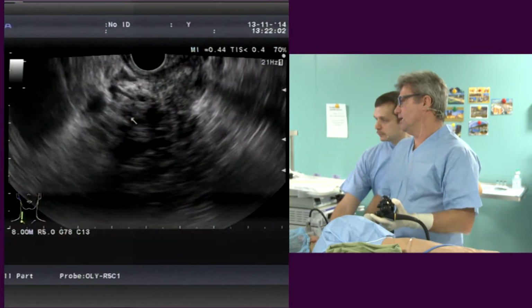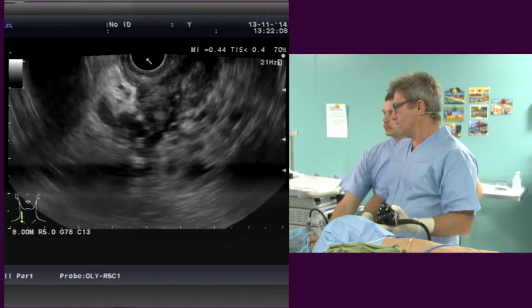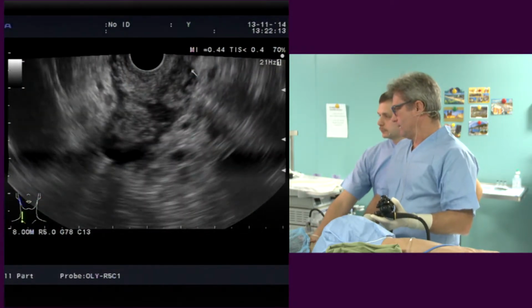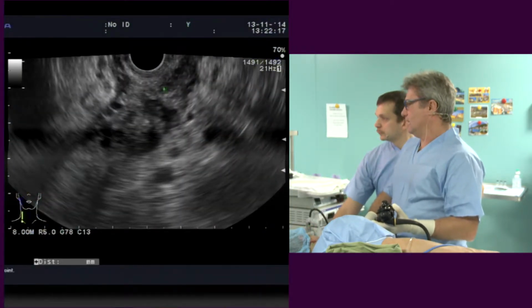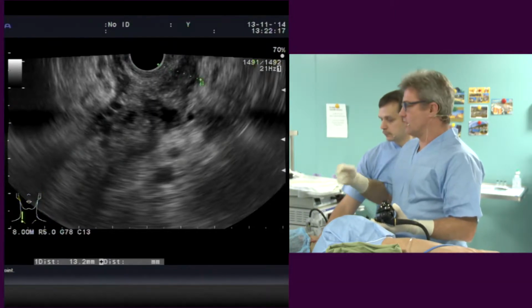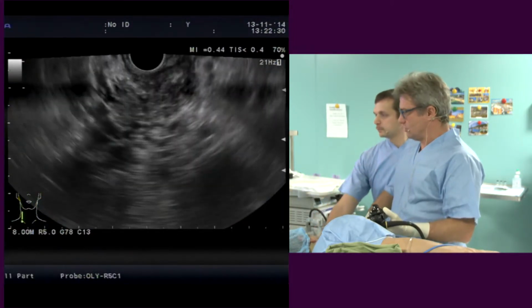So what you see afterwards is a dishomogeneous tissue that, because the duct is normal, is most likely an inflammatory process that involves also the wall of the duodenum. You see the wall of the duodenum is all thickened, and this occurs in acute pancreatitis or in patients who have recurrent acute pancreatitis or who, for example, drink too much.